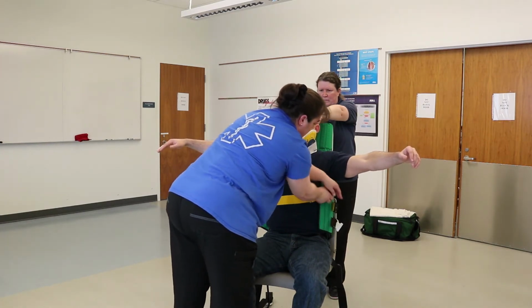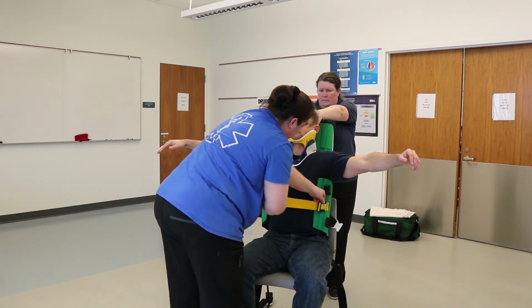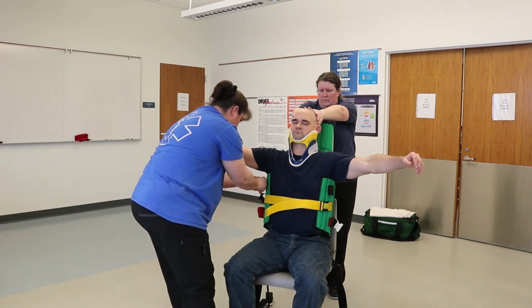Now I'm going to place the chest straps.